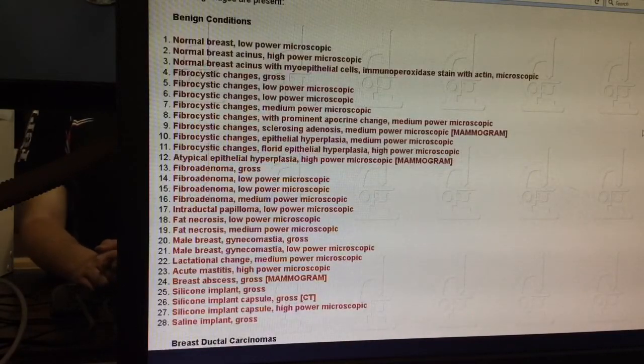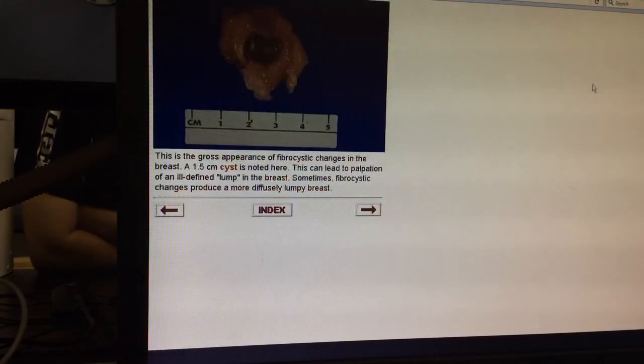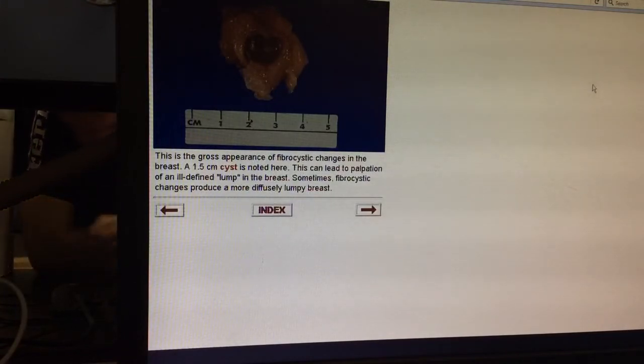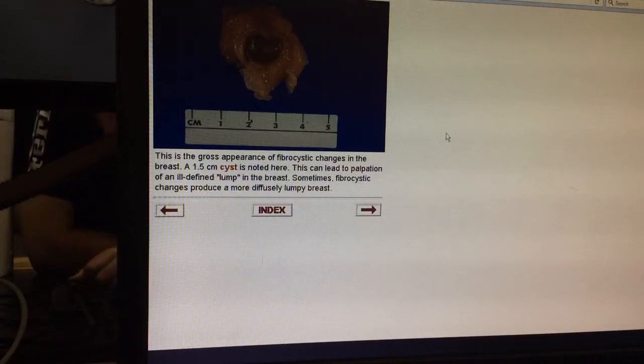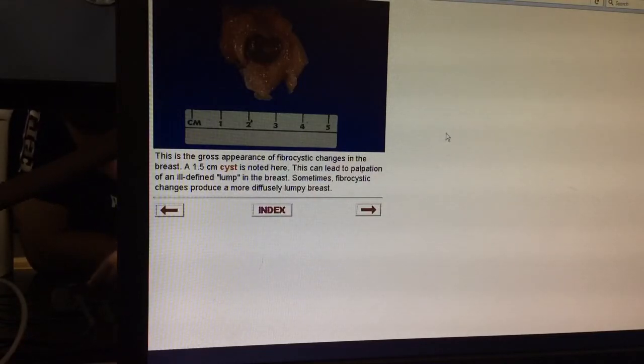Breast lesions are either benign lesions or malignant lesions. The first benign lesion is called fibrocystic change. It usually occurs in young females. There is a cyst maybe filled with fluid. When we call this a fibrocystic change, we usually mean fibrosis, adenosis, and apocrine metaplasia. Those are found in fibrocystic changes, which occur due to hormonal changes in the female body, in the breast tissue. So there is cyst formation, adenosis, fibrosis, and apocrine metaplasia.